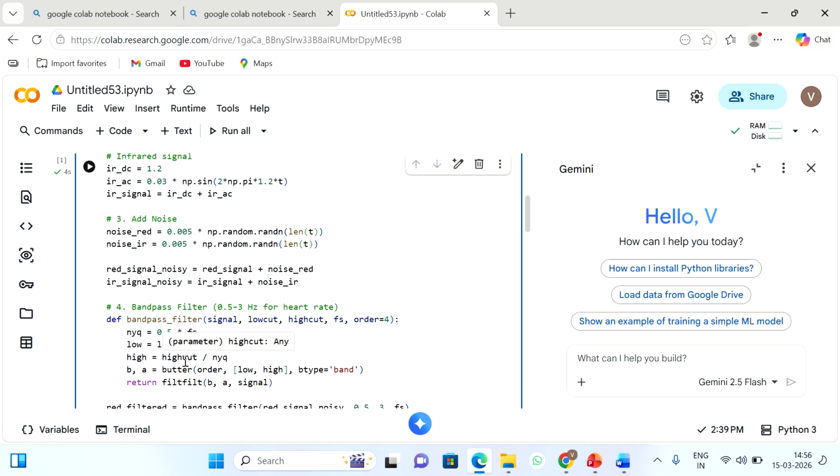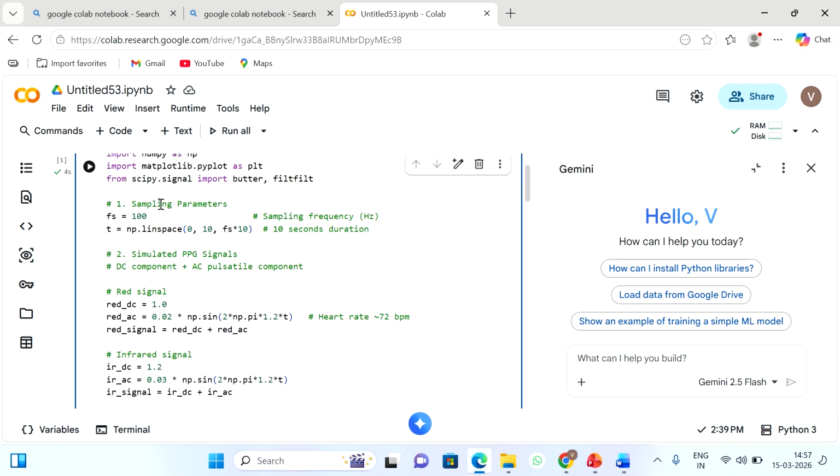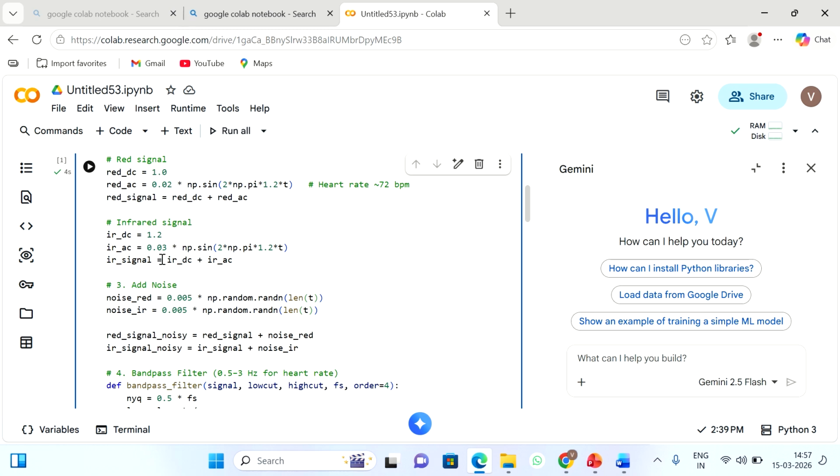So now we have to add noise, because normally a clean signal will not be taken as input, as anyway the noise will be included. That is why we have to assume that the red signal and IR signal are added with some amount of noise, a small amount of noise with a very small magnitude, 0.005, and then noise_red is equal to 0.005 times random randn of length. So what is the value? Random numbers are generated, and while sampling, the same length as the original signal will be taken for the noise also. See, the number of samples per second, if fs is equal to 100 for the raw signal, the same thing is maintained for the noise also.